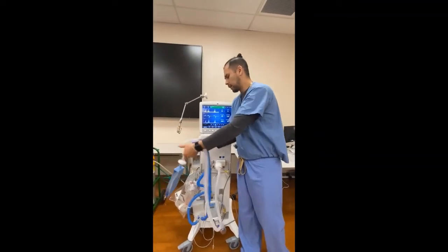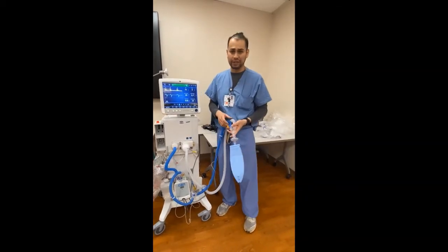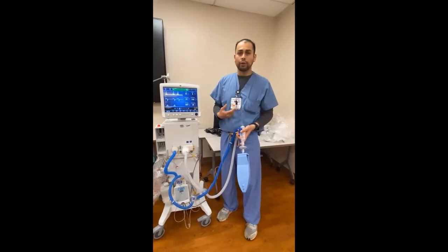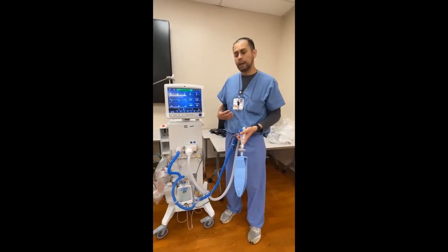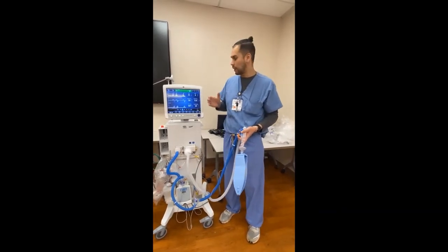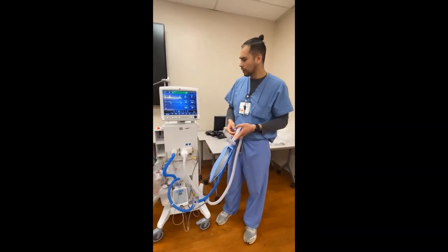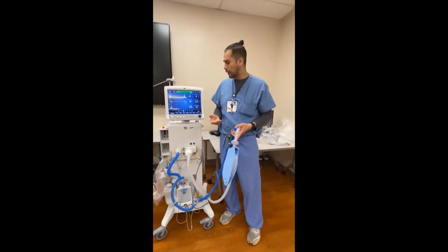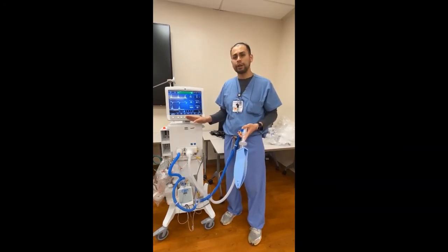The other thing that we can also see, internally from the patient, is an elastic resistance, which is the compliance of the patient. If they're in ARDS or having very poor compliance in their lungs, very whited out lungs, that will tend to drive up the peak pressures because there is stiffness in the lungs, causing a higher amount of peak pressure to help ventilate the patient. We would have to notify the doctor if the patient is fully sedated and breathing at the set rate on the ventilator, but they're still hitting high peak pressures.